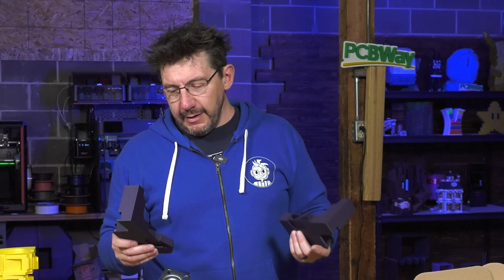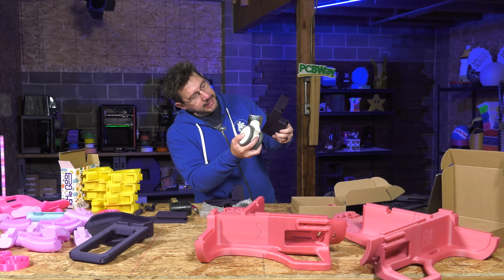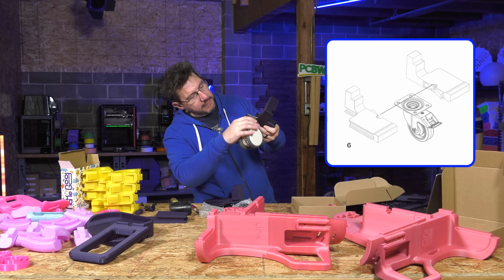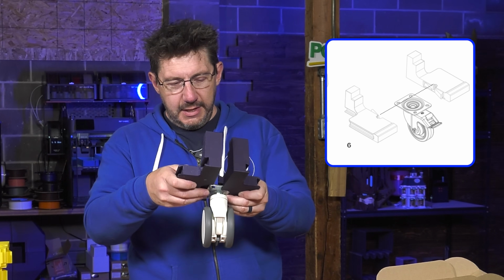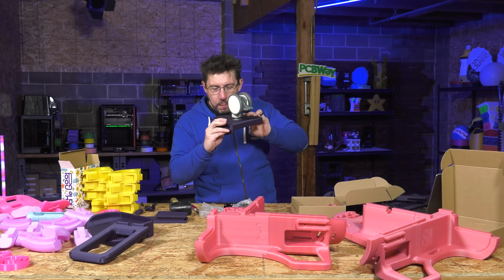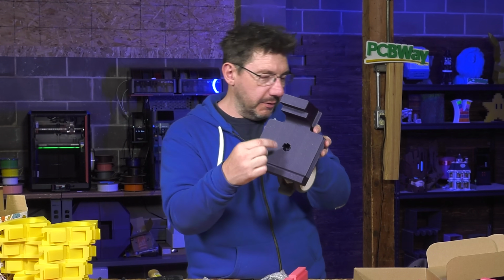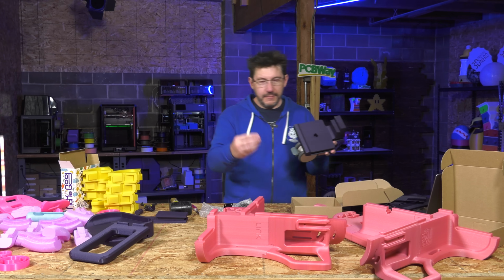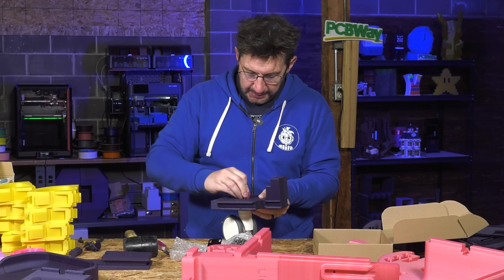So at this point, now we've got our caster holder. So this is gonna hold this big caster. And it's kind of nice because you just slot it in like this. And then you slot this in from the other side. That's literally it. Look at this. It holds it. And it's got that very familiar place to put the little nubbin to hold it in. And I've got a nubbin right here, and it's the right height. So I'm gonna put it in and give it a few taps.